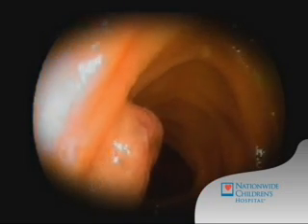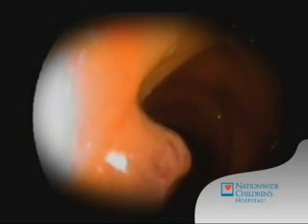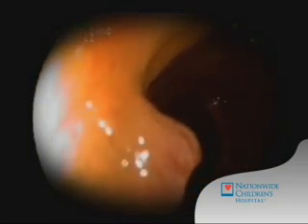Once identified, the polyp — or in this case, the hemangioma — is studied to see if it can be successfully pulled back or isolated from the wall of the small intestine.